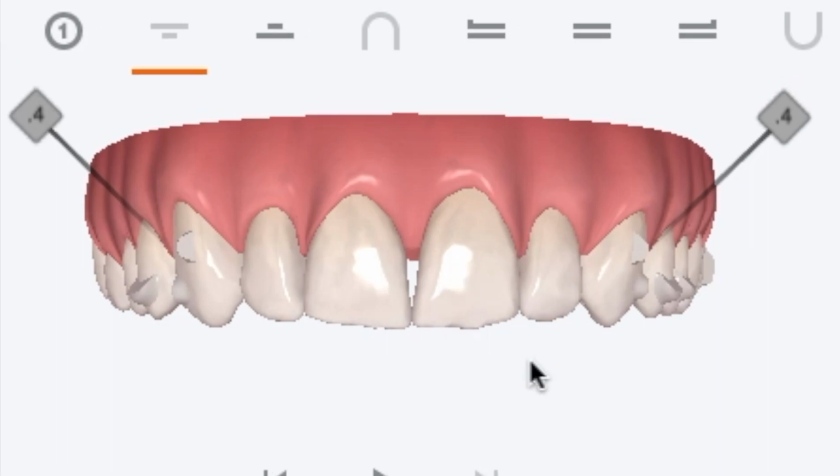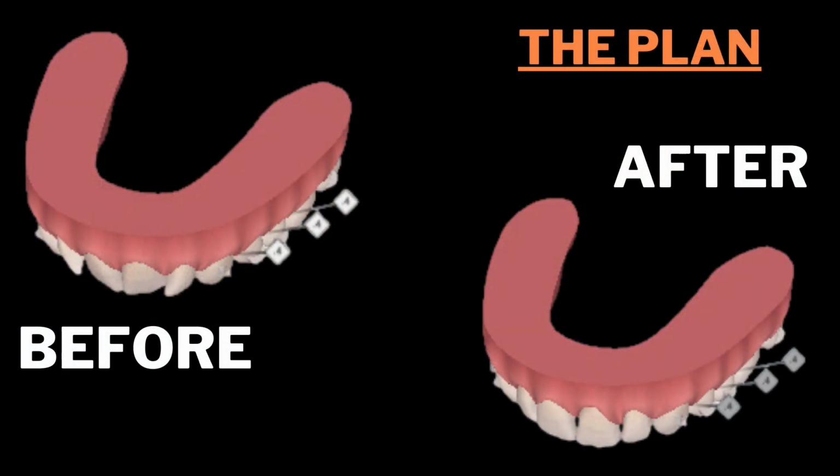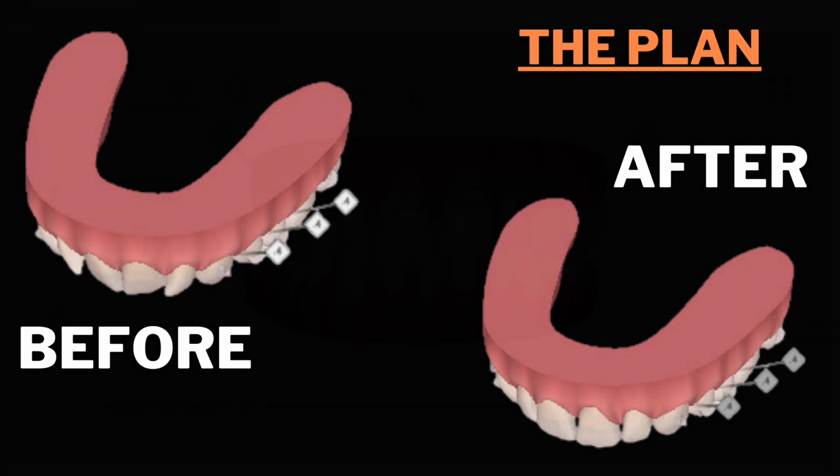and line up together. So you might notice that as my front teeth kind of untwist, it gives me a gap between my front 2 teeth. I'm okay with that. There's nothing wrong with a gap between your teeth. Gaps are cute. And in this case, I did another kind of tilted view so that you can see from the right angle just how twisted up those front 4 teeth really are and how lined up they are at the end.